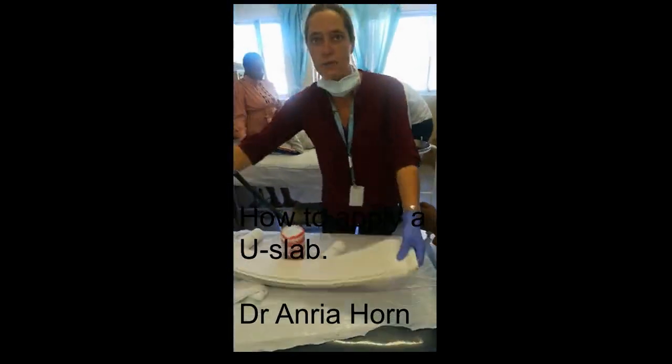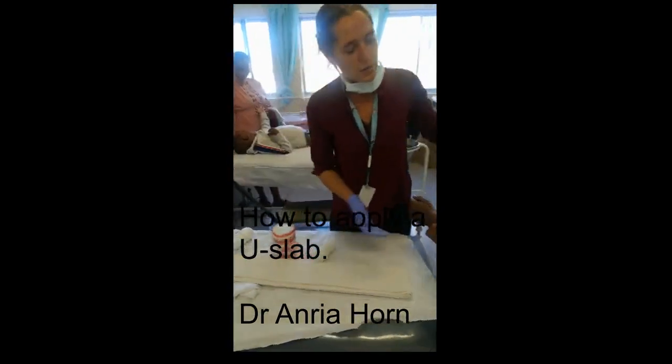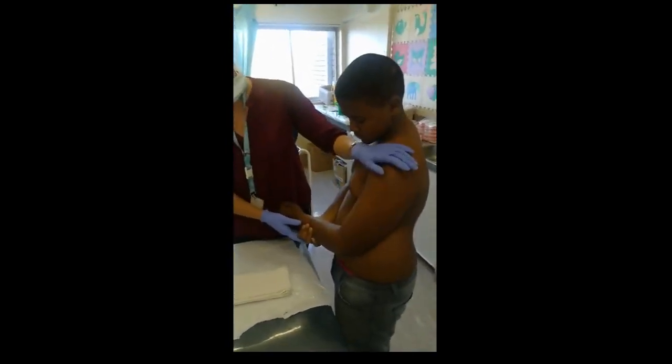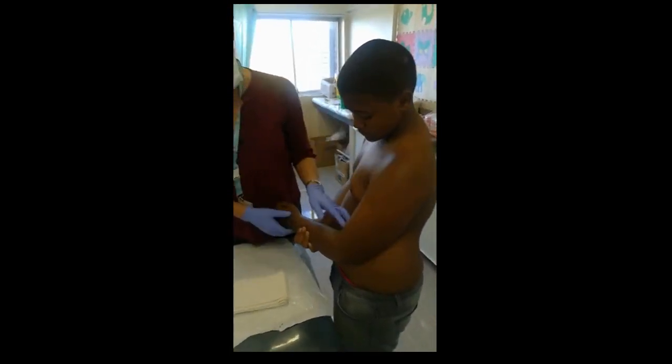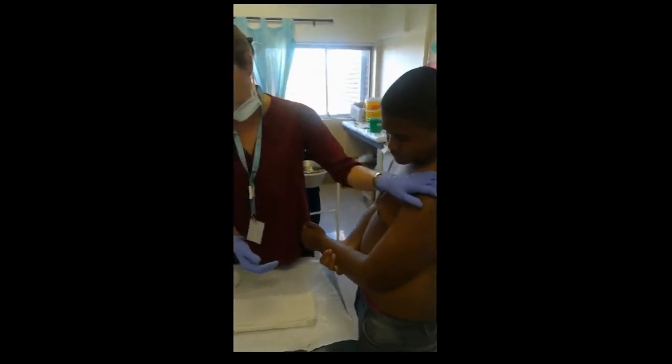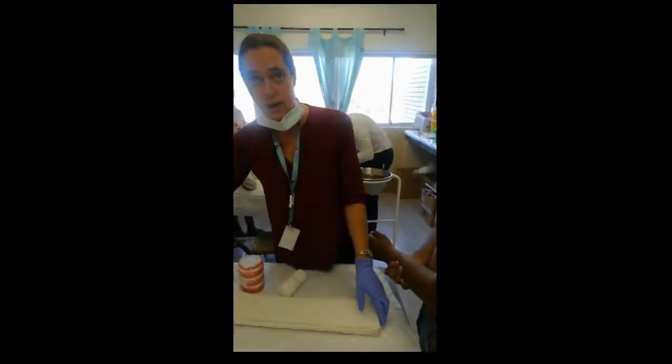This is a video to demonstrate how to put on a U-slab. A U-slab is used for the mobilization of mid and proximal humerus shaft fractures. As usual, we need to try and immobilize the elbow and the shoulder, but it's very difficult to immobilize the shoulder. So I'm going to show you how I like doing it.